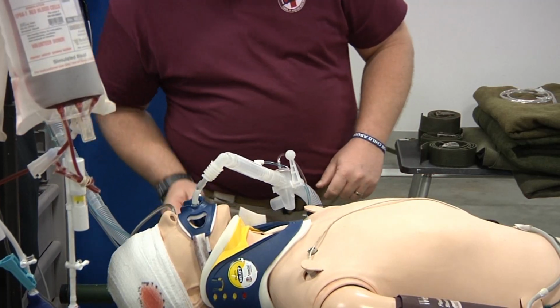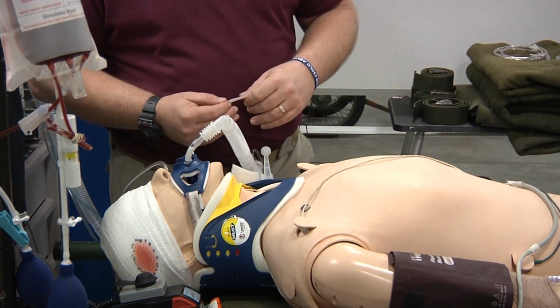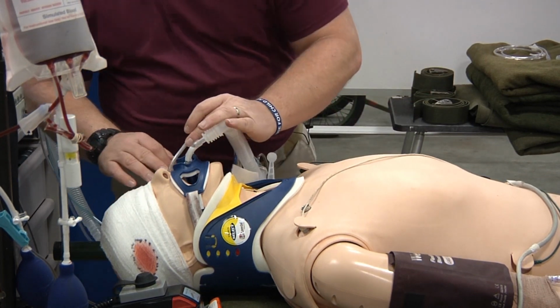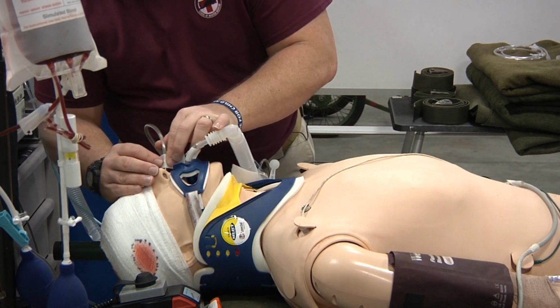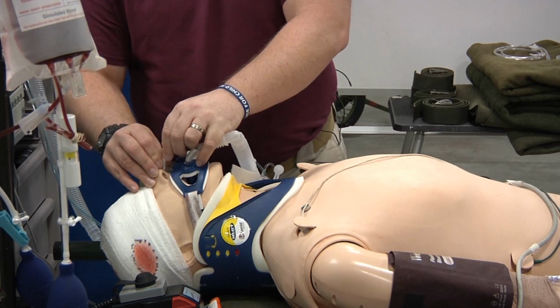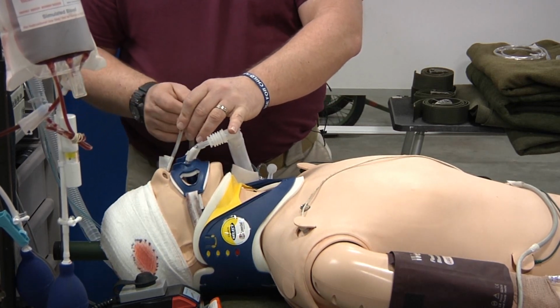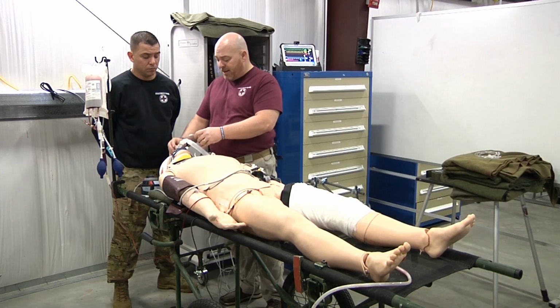The other thing that we need to do with our NG-OG is we need to check it for position, documentation, and security. So we're going to look at it. We're going to look at the numbers. All right. It's also recommended that you document the numbers and then flag it as well. All right. And this will let you know if it has gone in too deep or if it has started to come out too far and not becoming effective.